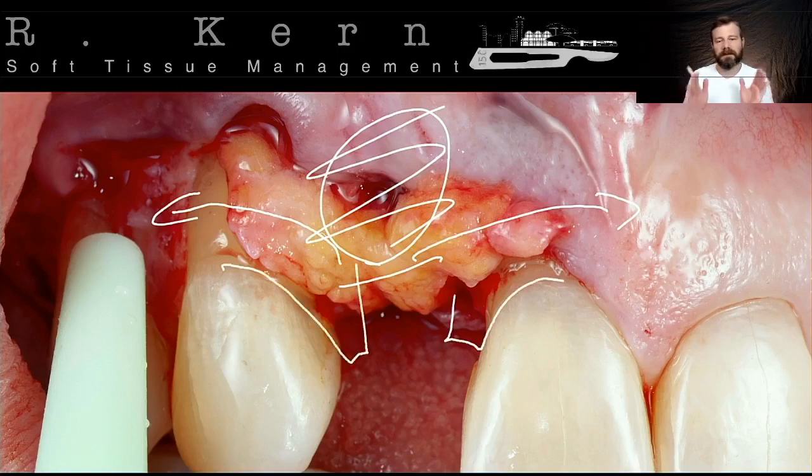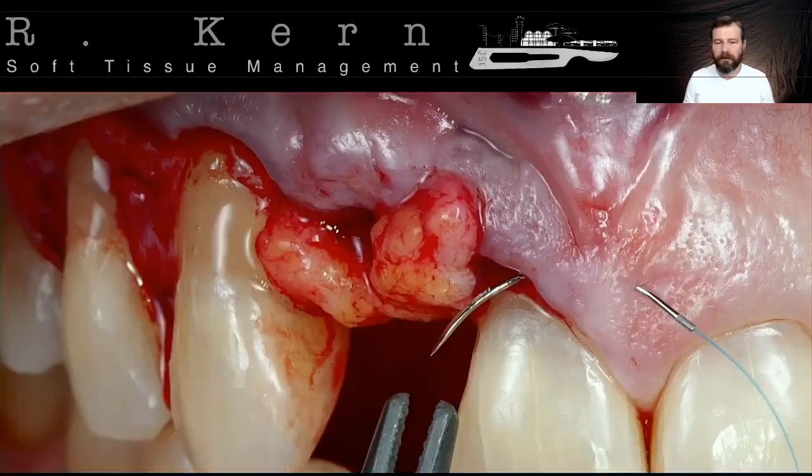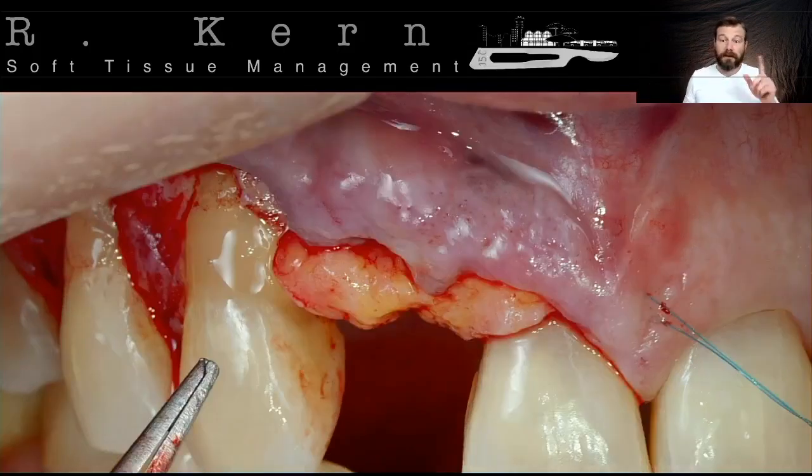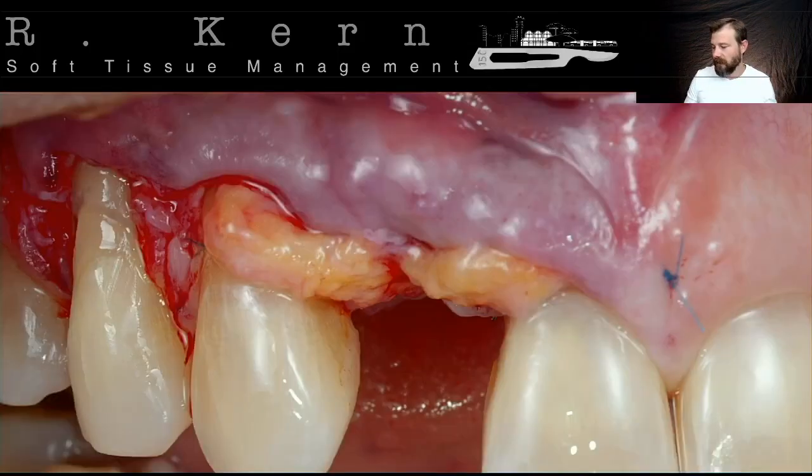That is important. That's why we managed to have this pediculum really fit in the base of this whole area. So this is my lateral anchorage from the surface under the flap, and from the flap engaging the pediculum, bring it mesially. Pay attention not to tie the knot too tight. Sometimes we use the plier on the opposite side to check exactly if you are centering the pediculum with this defect, okay? And another suture on the distal margin.